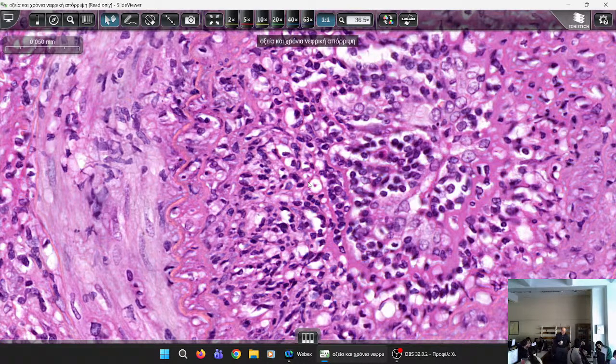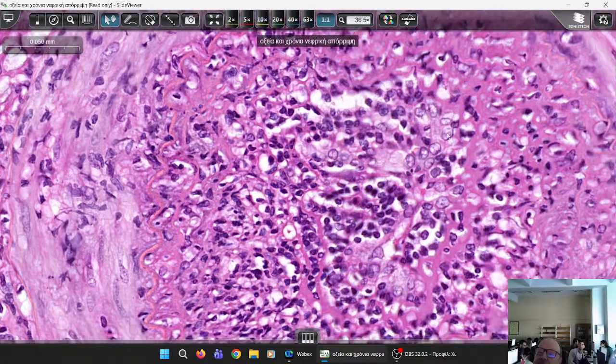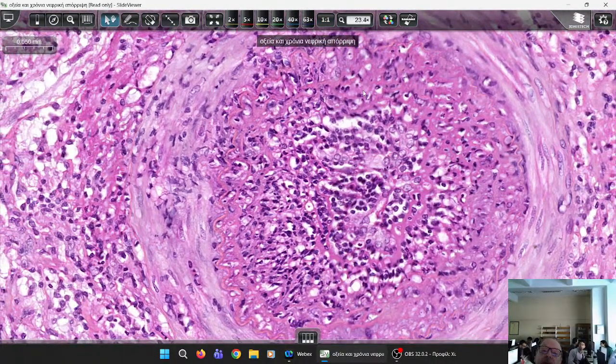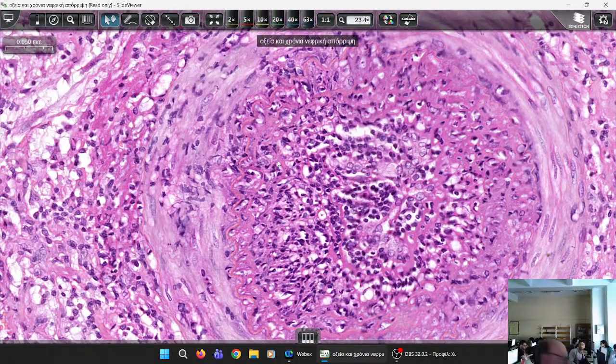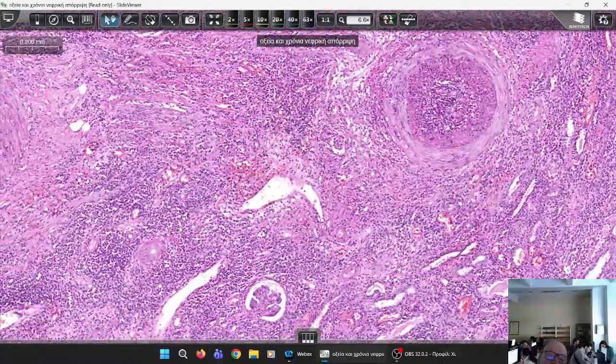Yes, it's the lamina, the elastic lamina of the arteries. And you see that all these cells have... this is vasculitis again, vascular rejection. And what is the hallmark of vasculitis? What can all these quite dark staining areas be in an inflamed vessel? What type of necrosis is this? It is, in vasculitis, fibrinoid necrosis. That's what happens in vasculitis. So we saw another artery.